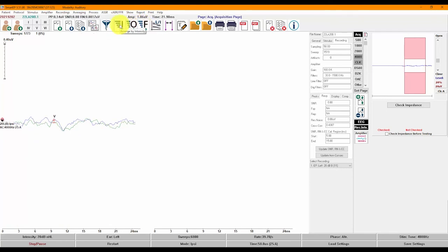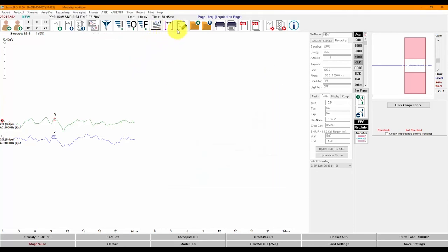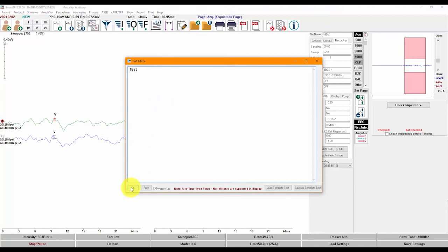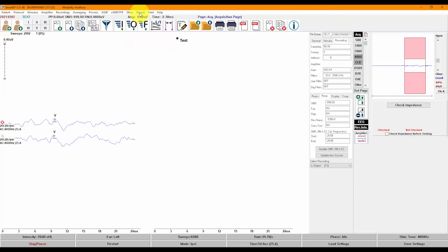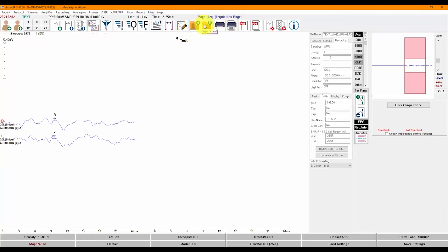You can also arrange recordings by rate by typing the R key. The next button opens a latency-intensity function which automatically plots based on labeled recordings on your page. You can add notes to the page. For those who often fax reports, there is a feature to increase the thickness of waveforms to make them more visible when printed. The last set of buttons are used to save or load a previously saved report, as well as printing or generating a PDF of the report. Finally, you can clear recordings either from the page or from all pages. The I button takes you to our manual for more information.